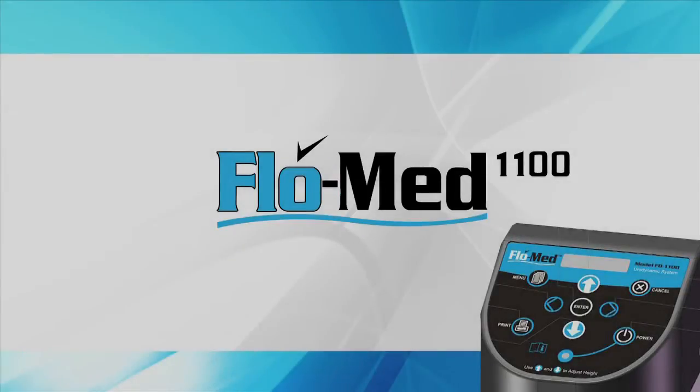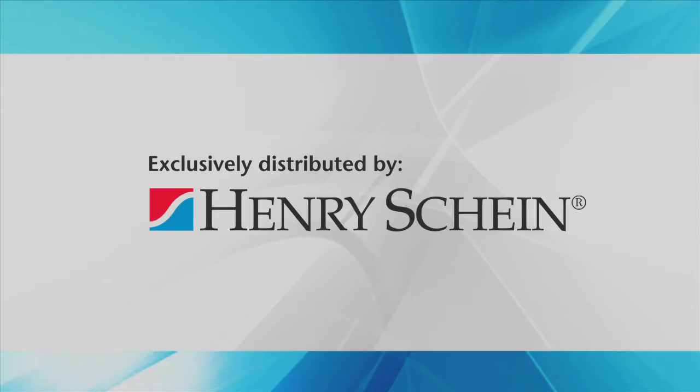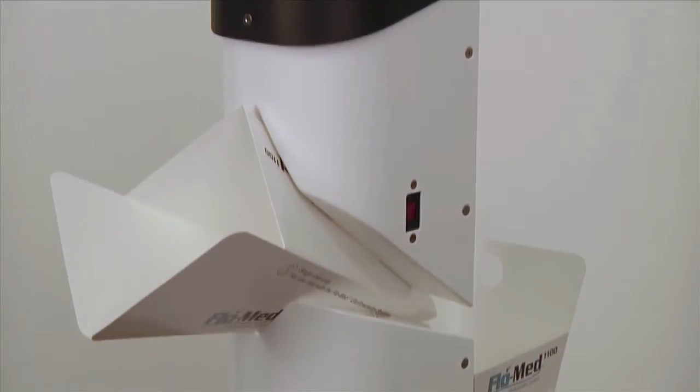This video contains information on the FlowMed 1100 Uroflowmetry device, made in the USA and sold exclusively through Henry Schein Inc. This device was designed for use by male patients, but with an adapter can accommodate female patients.